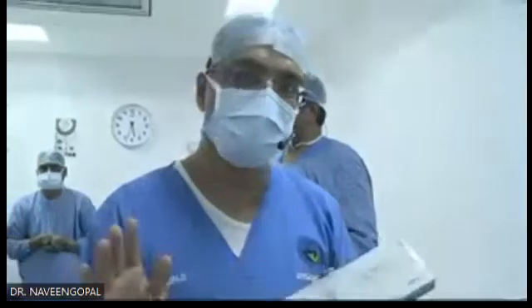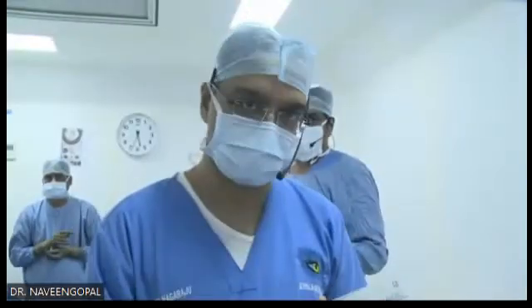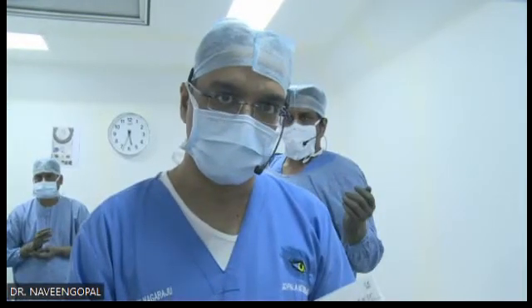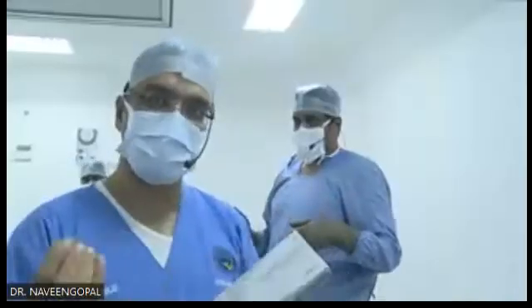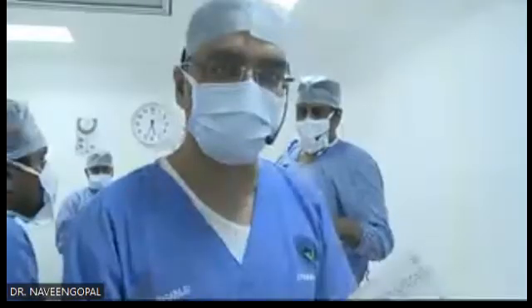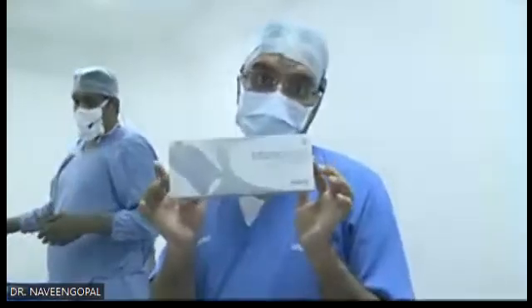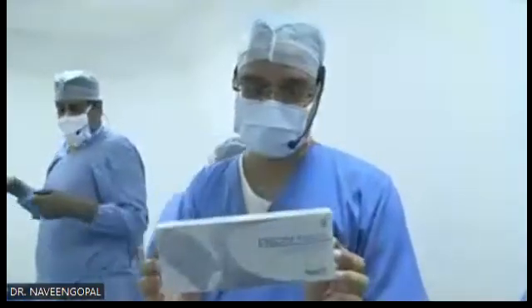Two things you need to know before you shift the patient. No need of any local injection. You can do it under topical anesthesia. Make sure if there is a steep axis of 0.5 and all, then you can give your incision of 2.8 along the steep axis, even if you are doing non-toric phakic IOL.